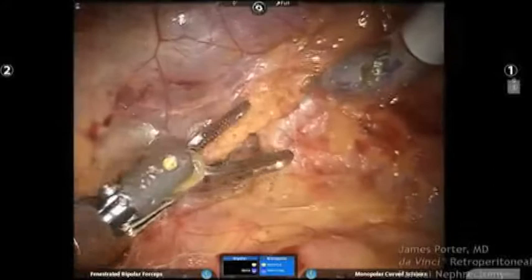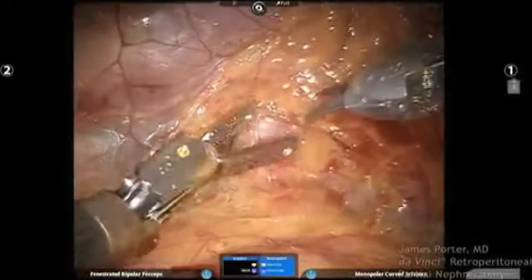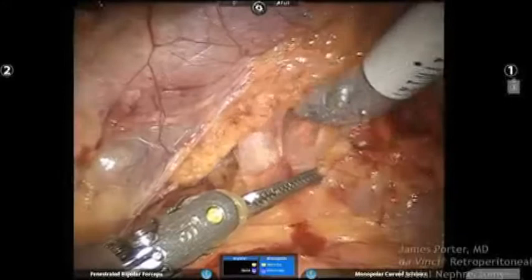Jim, obviously, with the retroperitoneal approach, the bulldogs are optimal for a hilar occlusion. But in a transperitoneal approach, your thoughts on Satinsky versus bulldog? Yeah, again, there's space limitations retroperitoneally. The Satinsky requires some space. A good question, but I just haven't tried it because it takes a lot more space to put a Satinsky in. So we've exclusively stayed with the bulldogs for a retroperitoneal approach.